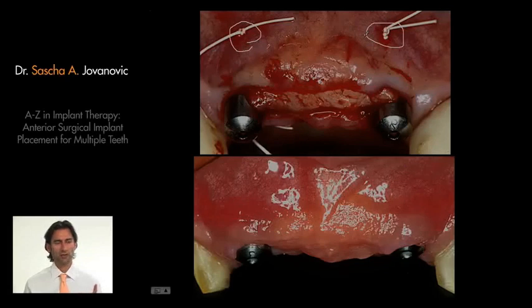So these two sutures here were used to anchor the connective tissue at the apex, so I can stretch it and place it exactly where it needs to be, and it can then allow this area, as you can see, to get extra tissue in the front. So I'm using connective tissue purely to augment the ridge for emergence profile.